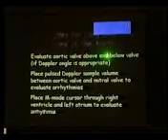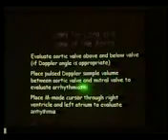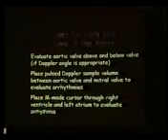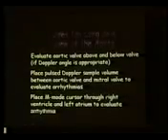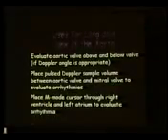Evaluate the aortic valve above and below if the Doppler angle is appropriate. Place pulse Doppler to evaluate arrhythmias, and place the M-mode cursor through the right ventricle and the left atrium to evaluate the arrhythmias. That means you can crisscross the ventricle to the atrium and see whether they are synchronized or not. If they are not synchronized, that means a more detailed study and more views have to be taken, which we are going to talk of in a minute.